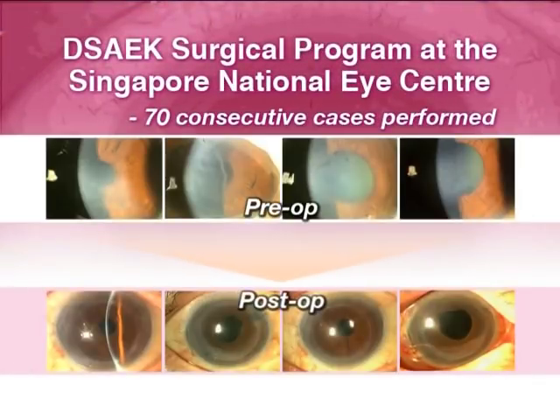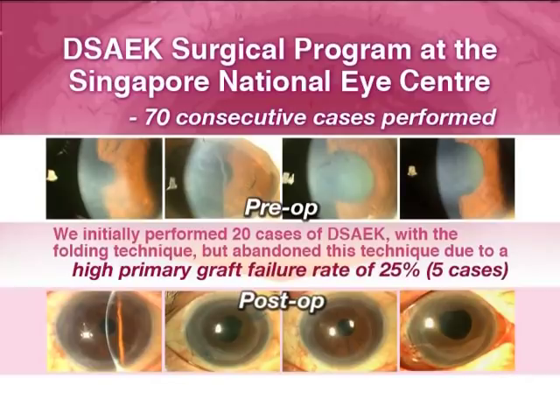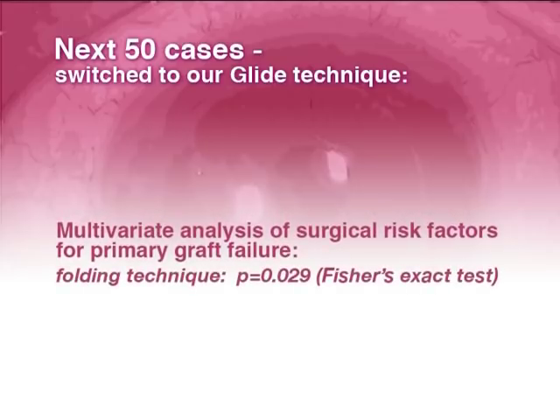We have now performed 70 cases of DSAEK in Asian eyes for various forms of endothelial decompensation. We initially started with the conventional taco folding technique in our first 20 cases, but quickly abandoned this when we experienced 5 cases of primary graft failure, an unacceptably high rate of 25%. When we switched to our new glide technique for the subsequent 50 cases, we immediately noticed a significant improvement in corneal clarity in the early postoperative appearance.